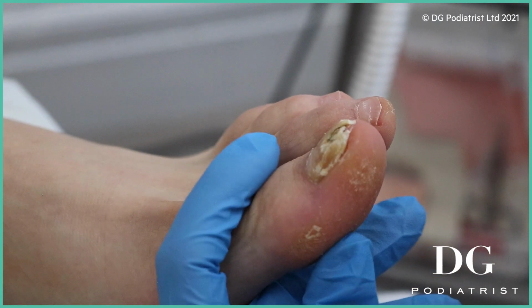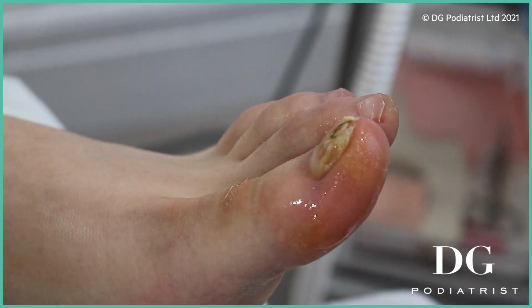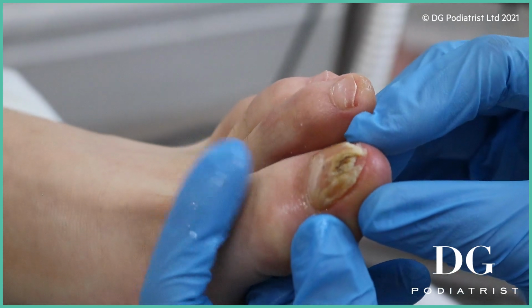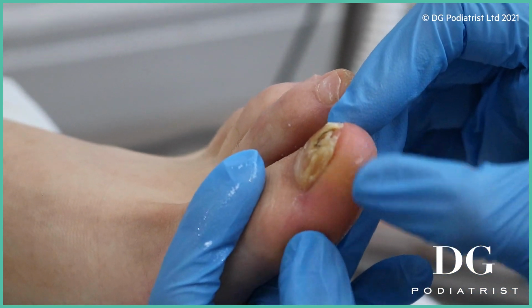Practical, just going to spray it with the antibacterial. Right, so you can definitely see we've got a fungal element in the toenail here. And it looks like there was a history of some trauma to the nail as well, right? Yeah. And I can tell by the callus that you have on the side of the toe that you are getting that kind of impact in that region.